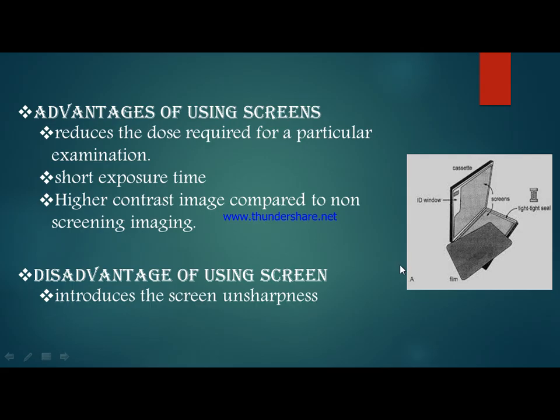Advantages of using screens. These are the advantages of using screens: they reduce the dose required for a particular examination, they have short exposure time, and they give a higher contrast image compared to non-screen imaging. And a disadvantage of screens is that they introduce screen unsharpness.